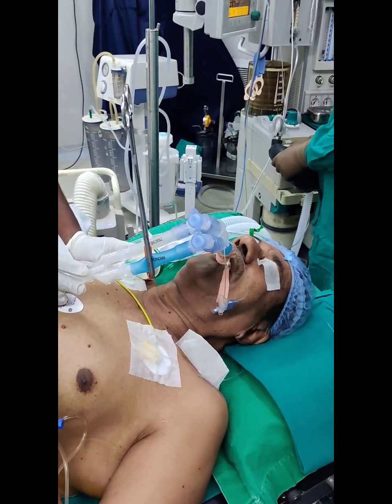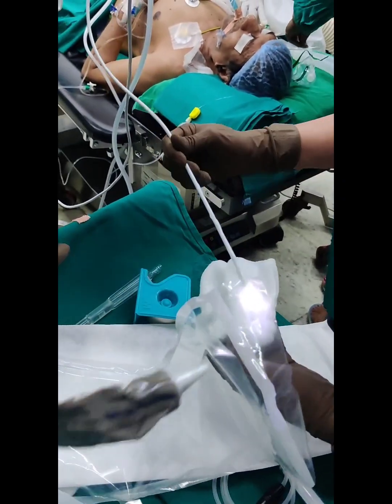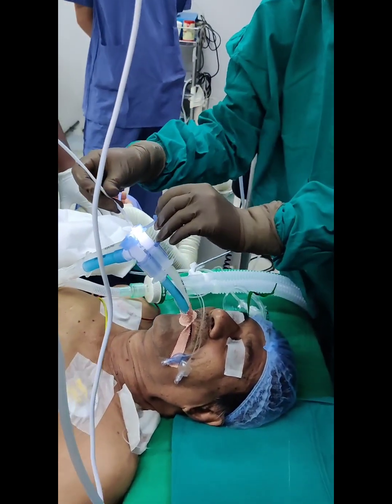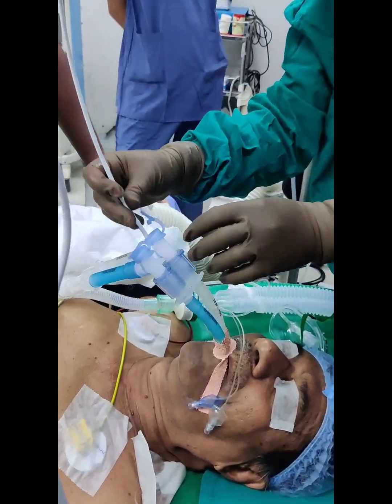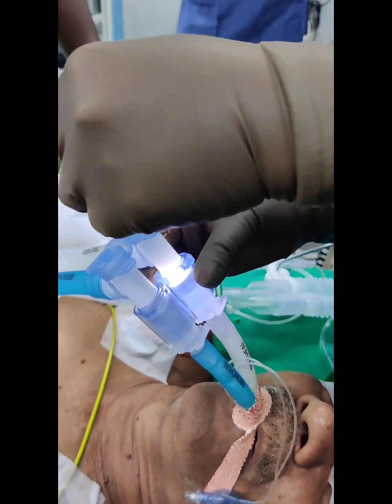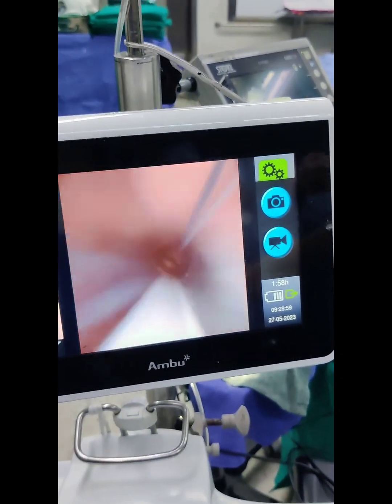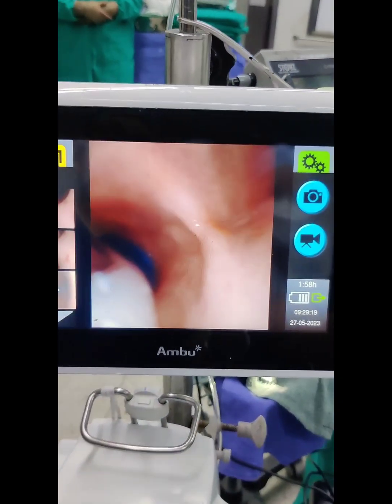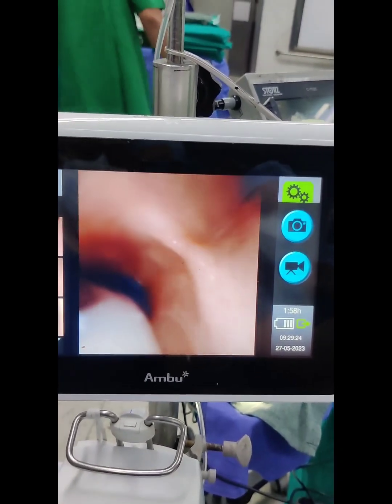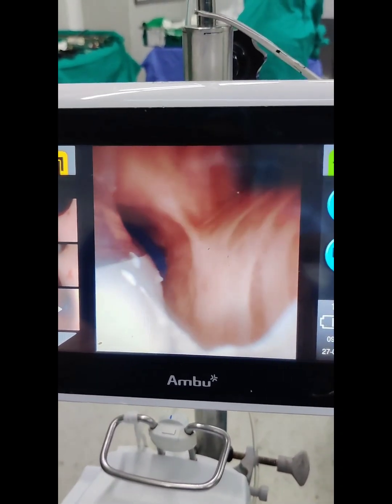A fibre optic bronchoscope is considered the gold standard to confirm correct placement of the bronchial lumen of the DLT. A paediatric fibre optic bronchoscope is well lubricated and passed through the self-sealing adapter of the Y connector into the tracheal lumen. Once it emerges from the tracheal lumen, the carina is visualised to verify the bronchial tube is in the correct main stem bronchus. Confirm that the blue bronchial cuff is just visible with no cuff herniation over the carina.